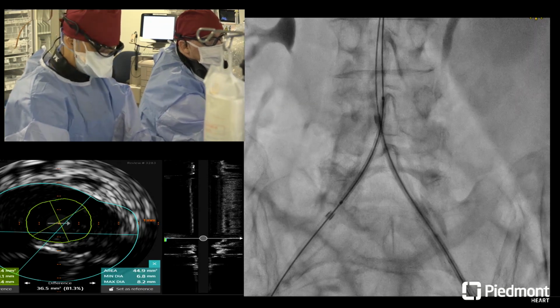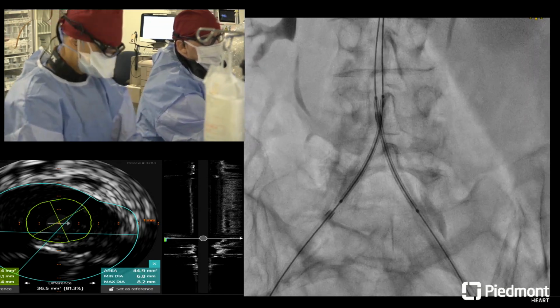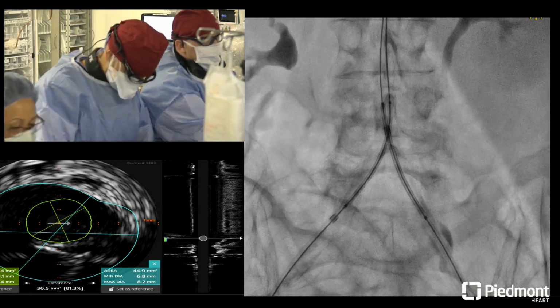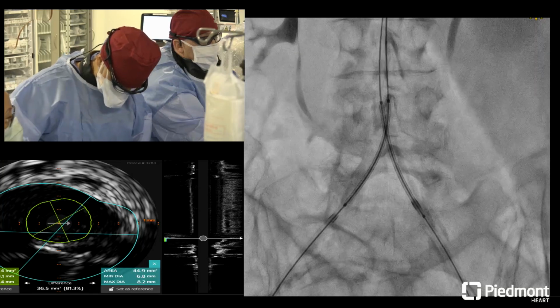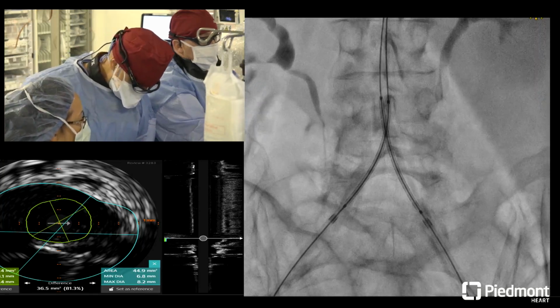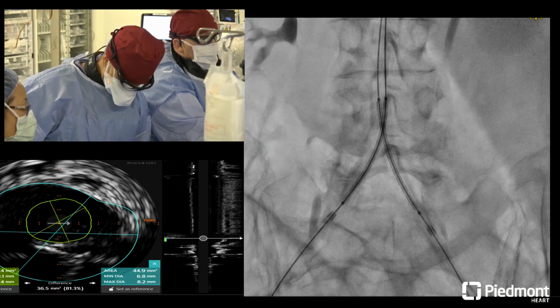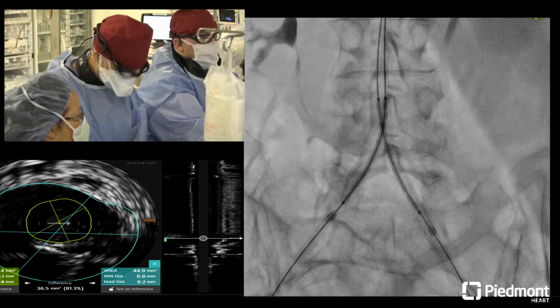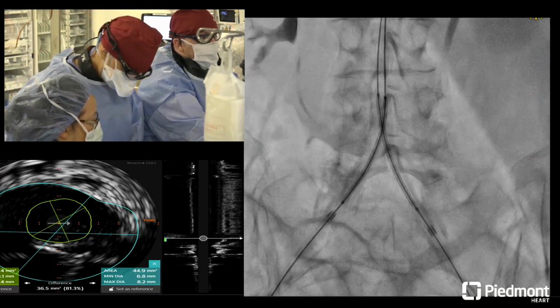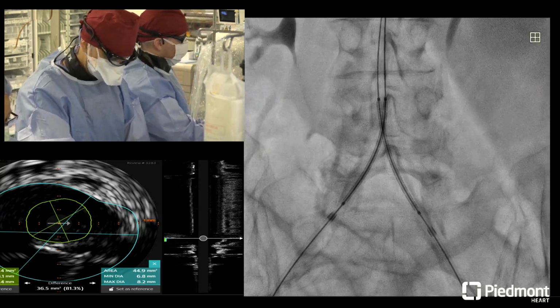I wanted to take that picture just before I start putting stent in there and block it up. I mean, I realized this is not a 30-year-old woman or a 50-year-old woman. She's got advanced disease, and I've got to be mindful of just why we're doing this. I don't want to make her worse. You've got a subclavian to fix also still. I think the subclavian is going to have to wait, my friend. Definitely the mesenterics are going to be an issue.